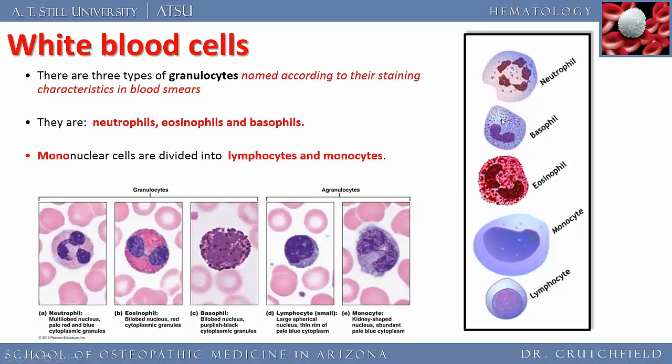We're going to learn that they secrete heparin and histamine, which you guys know what histamine is. And a neutrophil, of course, is a white cell. And then we're going to go into the mononuclear cells, which basically have a nucleus made up of one shape. So here we have a lymphocyte. We're going to see later how a lymphocyte gives us T and B lymphocytes and then plasma cells that secrete antibodies. And a monocyte, a larger cell with sort of a kidney-shaped nucleus.